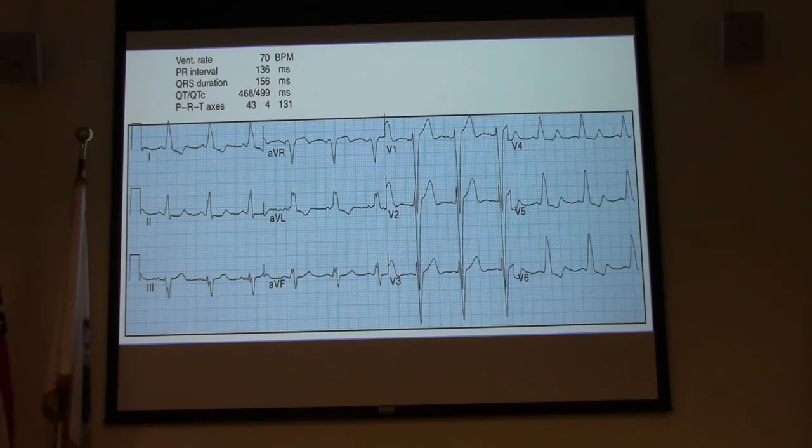Now a lot of people, when they look at it, will say, oh look, I've got these rabbit ears. Rabbit ears do not always mean a patient is in a bundle branch block. You cannot define or diagnose a bundle branch block without a 12 lead. You must have a 12 lead in order to diagnose a bundle branch block. Okay?